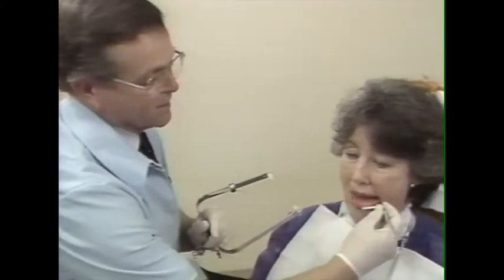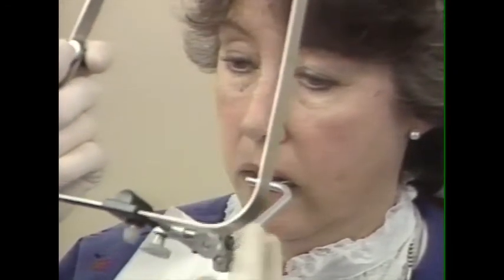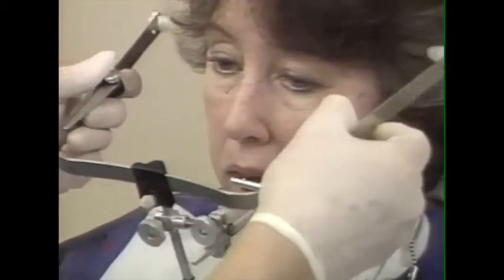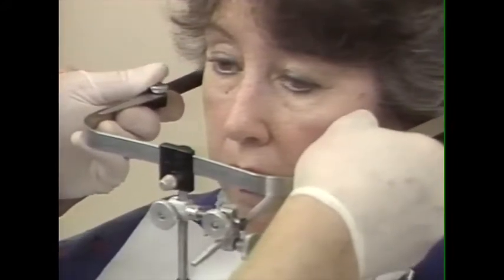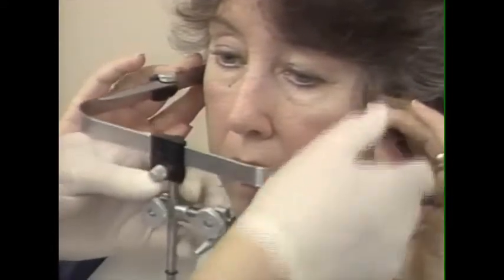Securing the face bow record is actually a very simple procedure. We first place the bite fork into the mouth. Be sure that it's in the proper indentations. And we've previously loosened all of the clamps. We slide the number 3 clamp onto the bite fork and spread the ear rods. Have the patient help us insert them into the ears, like so.